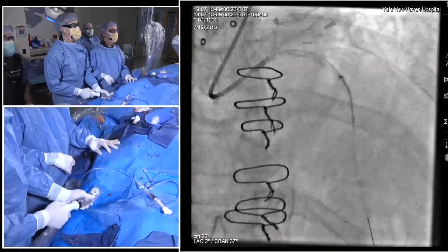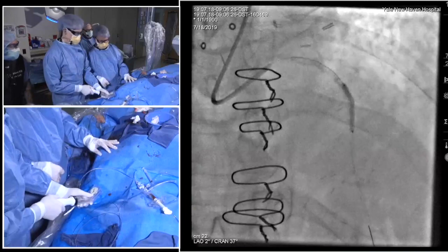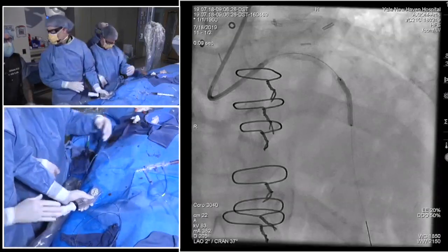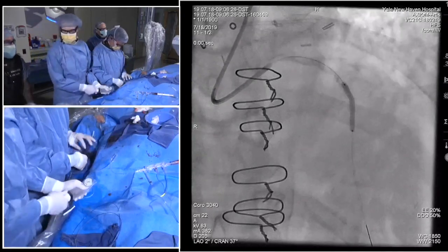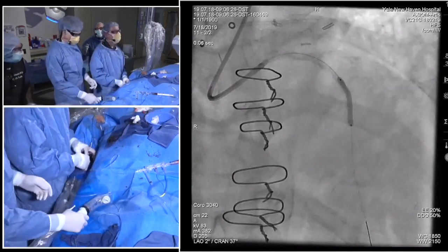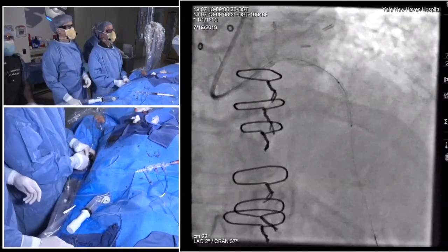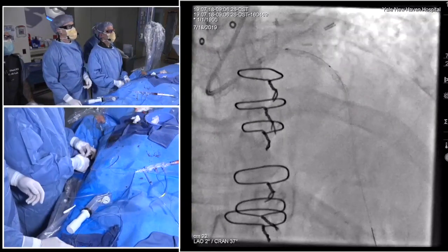as Kate said, our patients bleed and they can be at higher risk. So we want to really be able to know what the optimal duration would be. Yeah, especially with Synergy. If we know that this is an issue, we often will choose Synergy if we're looking for 1 or 3 months, just because the data is a little bit better on that. But I'm curious if you're going to 1 month in any patients, especially stable ischemic heart disease, or you're still waiting? We're typically not yet.